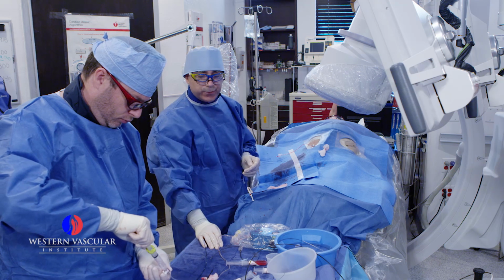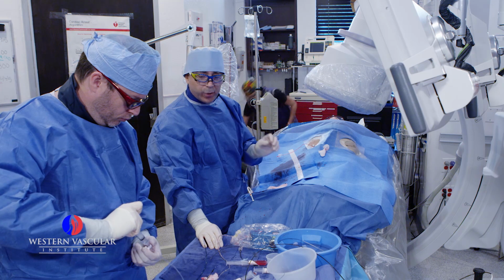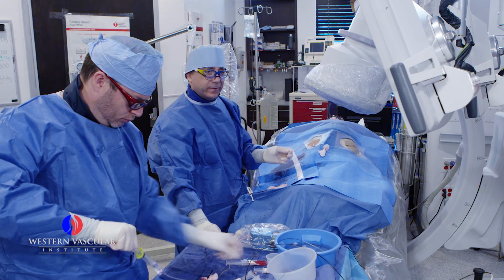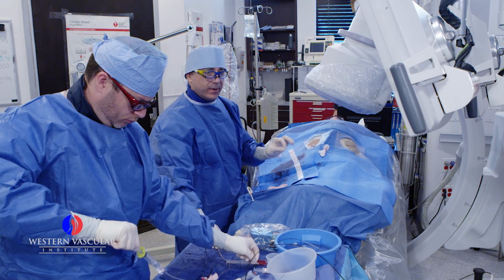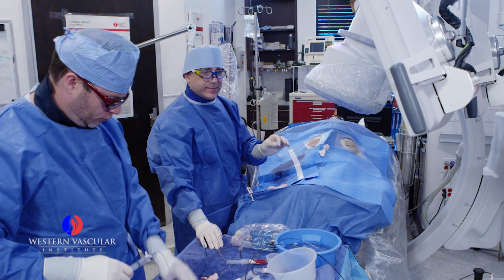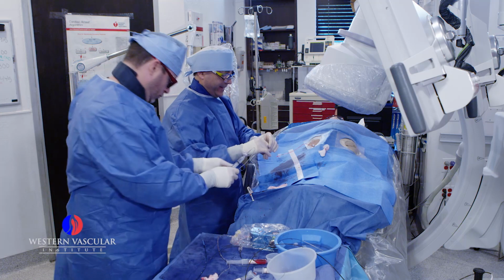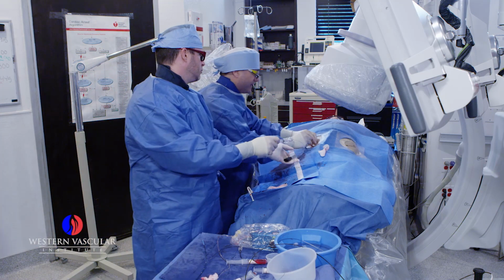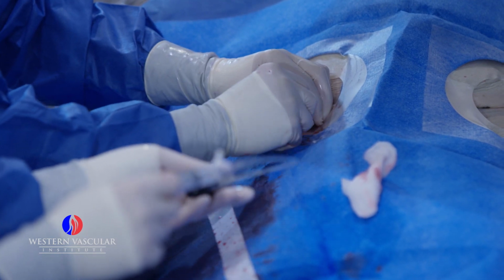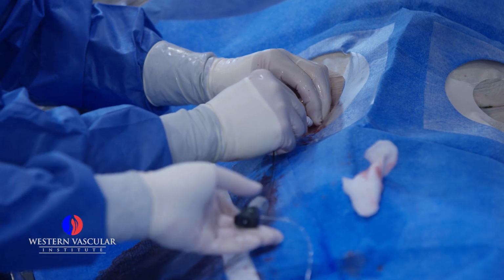Basically, this has a two-tiered collagen plug that sits on top of the artery. Part of the plug adheres to the wall of the artery so that it doesn't move. It adheres to the top part, right where the opening is, where the sheath went into the artery. And the second part of it is more of a collagen plug that expands when it gets moist, so that it tends to seal the opening. So it's a two-tiered system. The plug itself sticks to the wall of the artery and doesn't move.